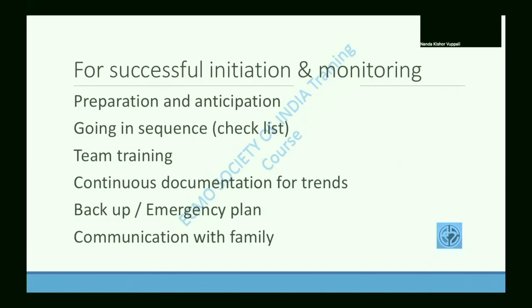And we need to document these trends, what's happening with the patient as well as the ECMO circuit, and how they're correlating with each other. And ECMO is quite an invasive mode of treatment and there are a lot of complications associated with it. And when they arise, sometimes we will not have time to act upon it. So we need to have some kind of a backup plan. What if something goes wrong? Whom are we going to call? How are we going to deal with it? Especially in the middle of the night, when not many people are around.